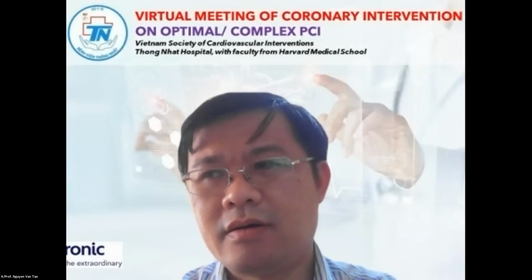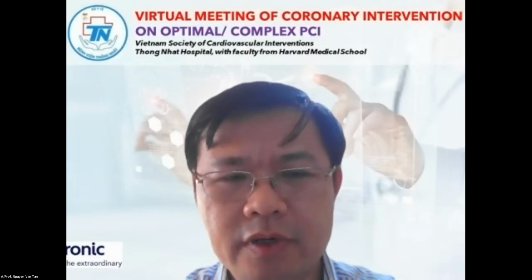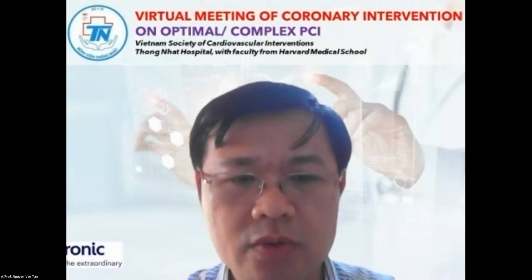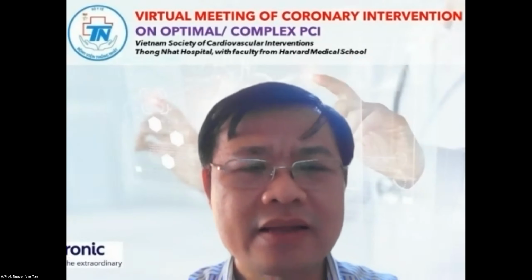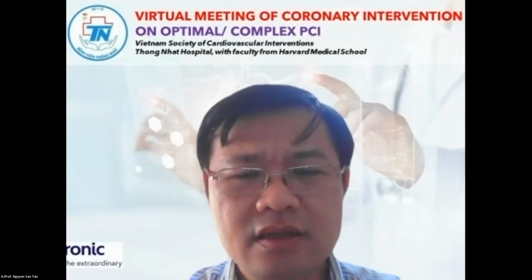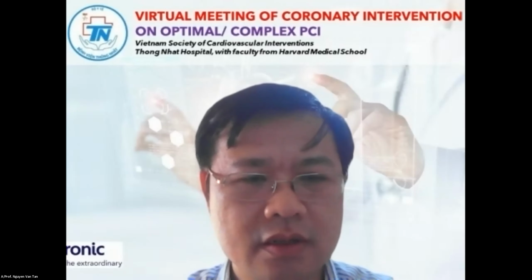Yes. Just a moment. In our hospital, we do not have many balloon pump cases. For some difficult cases, especially in cardiogenic shock, sometimes we use a balloon pump. In some cases we use VA-ECMO mode. The final result is that some cases are still alive, and some die. Actually in Vietnam, we have little data about mechanical cardiac support for cardiogenic shock. So I think in the future we should have a study and follow up the patients after we insert the balloon pump.